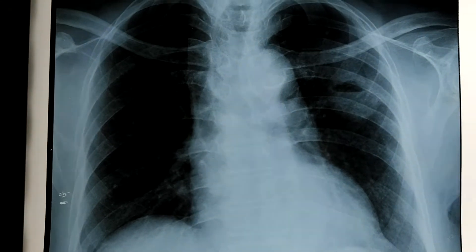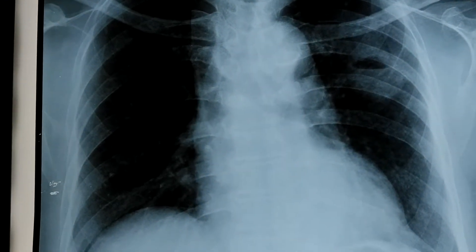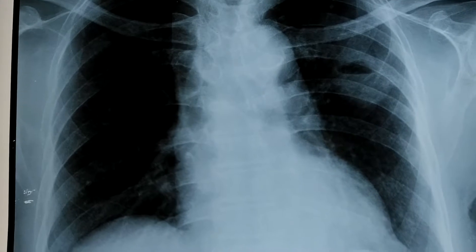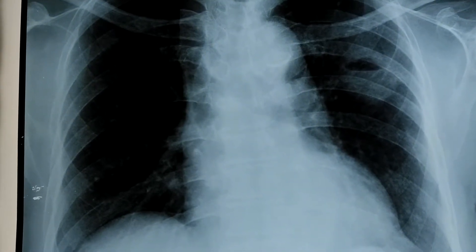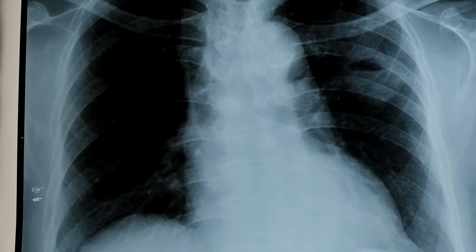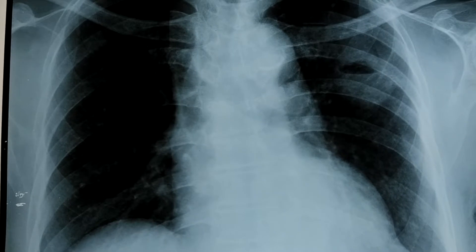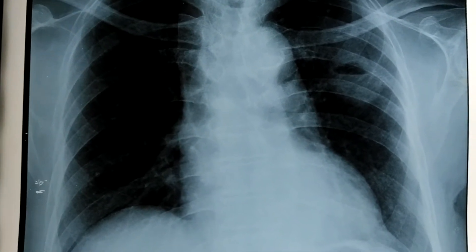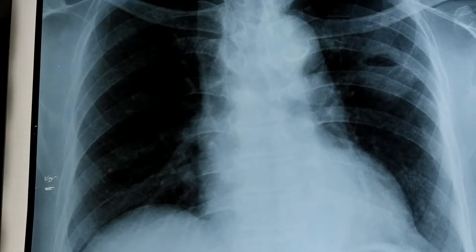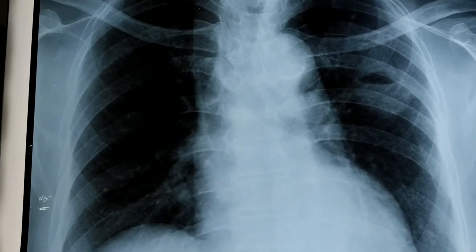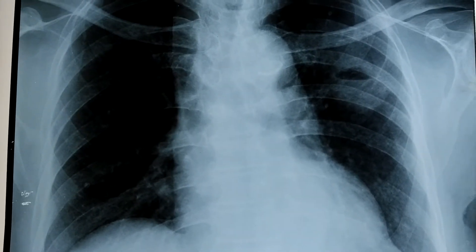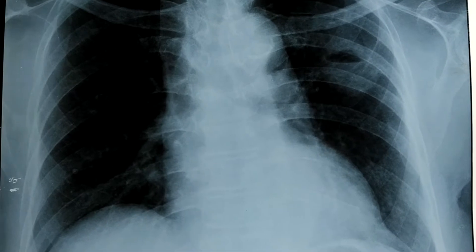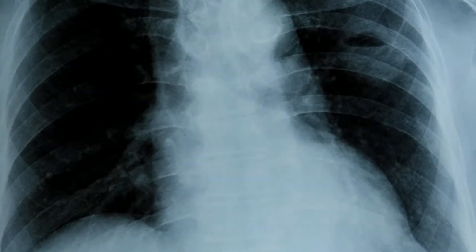This X-ray was taken from a 76-year-old male patient suffering from uncontrolled diabetes mellitus for the last 15 years. He suddenly developed high-grade fever with chills, cough, and left-sided chest pain, which was pleuritic in nature.